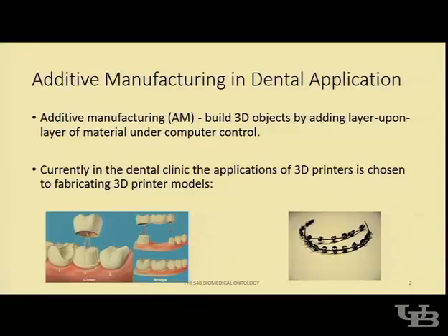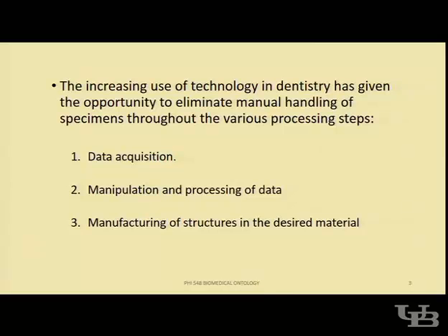Currently, these are some of the applications of the 3D printers that have been used in dental applications, which are the crown and bridge, braces, and also other medical appliances.